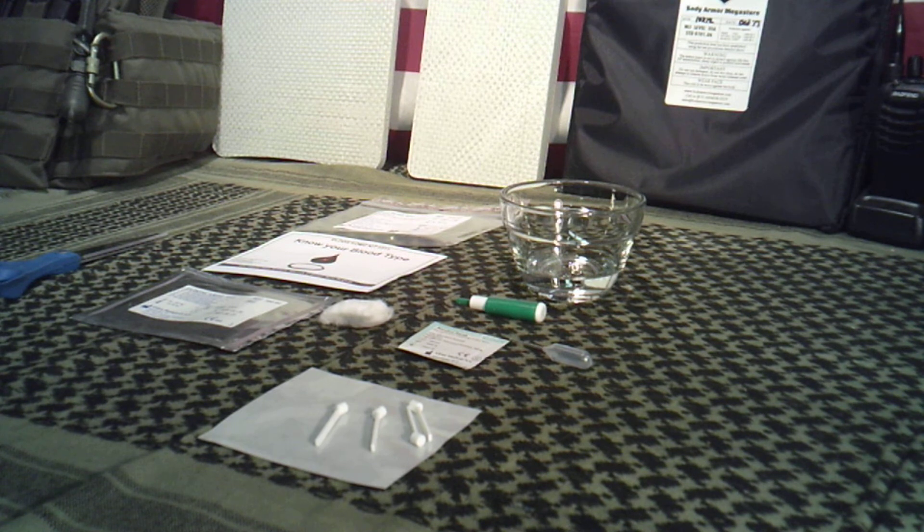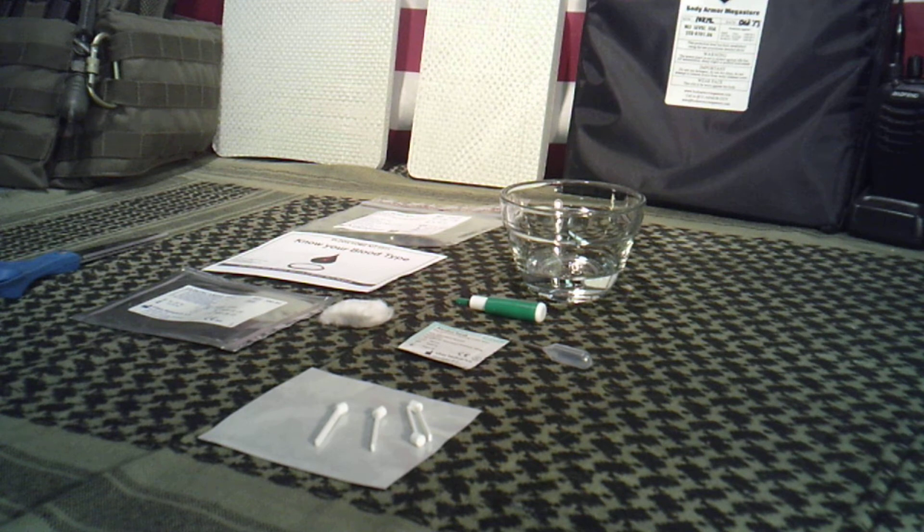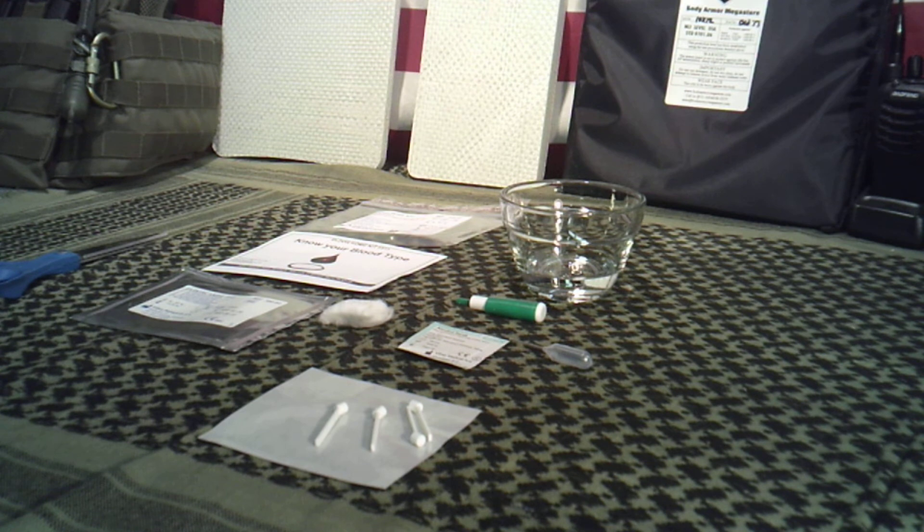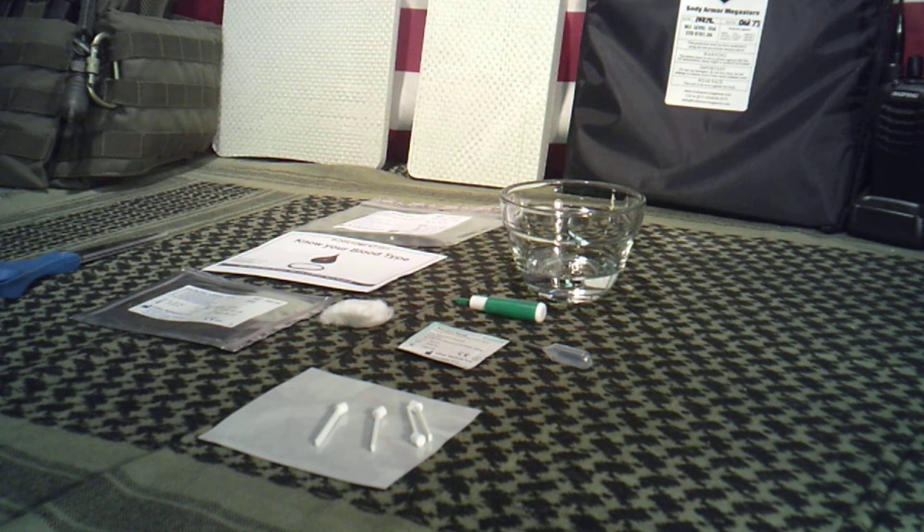But they do make home test kits that are very accurate, just as accurate as you would see in a hospital setting. Matter of fact, these are the same type kits that you'll see a lot of biological supply places, medical supply places that supply medical schools, things like that.